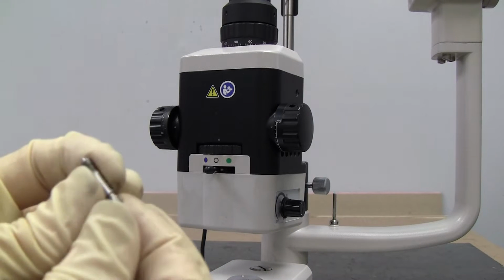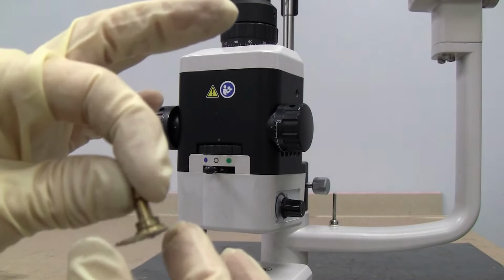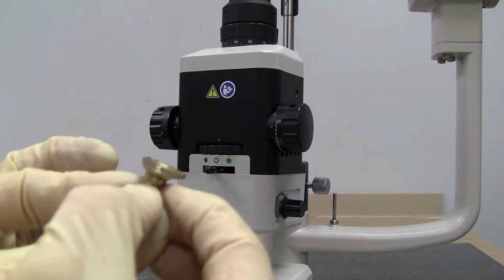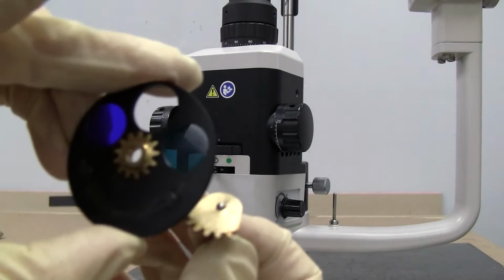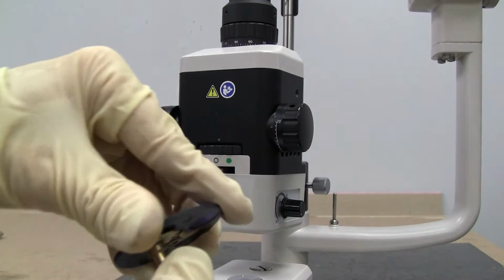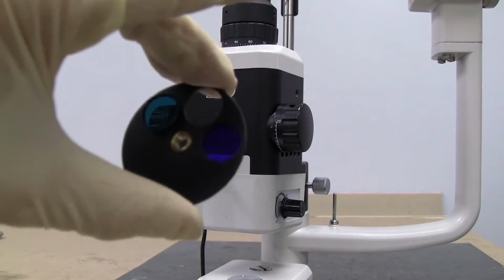But at the end of this lever, it's got a point, and that point goes right into here. And this is like a little gear that operates the filter wheel. Underneath the filter wheel, it's got a little gear, and that fits on there. And so when you're turning the lever, you're turning your filter.